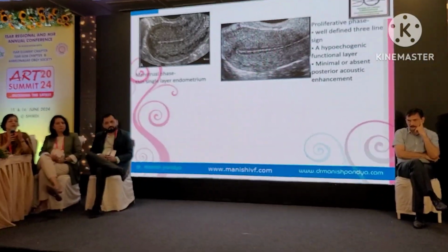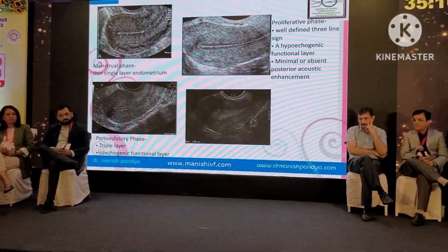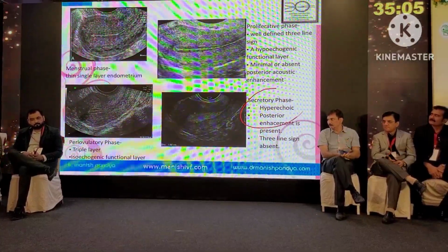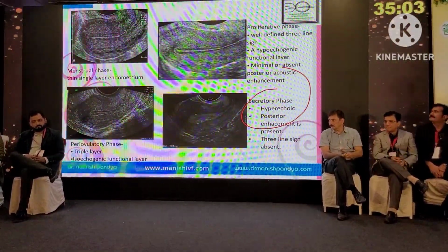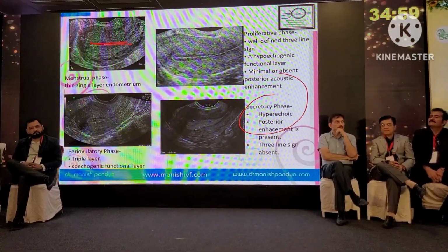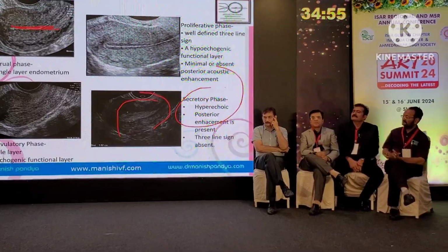Where the vascularity is reaching, accordingly you can have levels of endometrium, and the ideal endometrium is when it reaches the central echogenic line, that would be the best. But when it reaches zone 2, zone 3 or 4 also, the endometrium can be transferable and we can predict good outcomes.